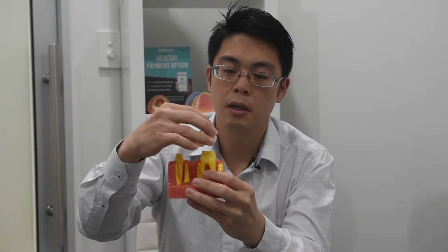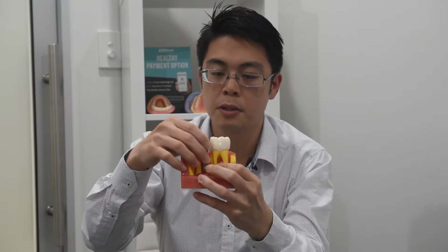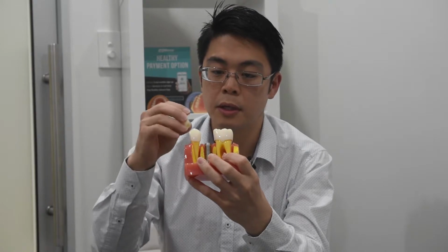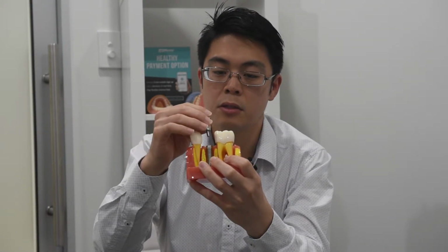That's why instead of doing these, we consider the implant, where the implant is a tooth by itself, an option where we restore the missing tooth by itself, where we don't affect the other 2 teeth next to it, and it is not an option where it comes in and out. So once we put the tooth in, it stays in, and it functions as a normal tooth.